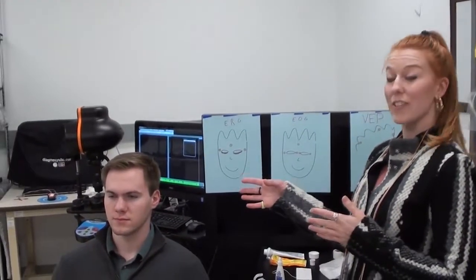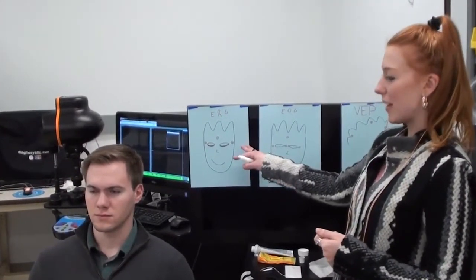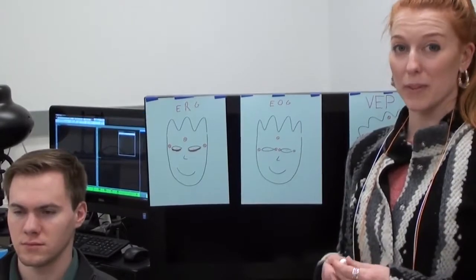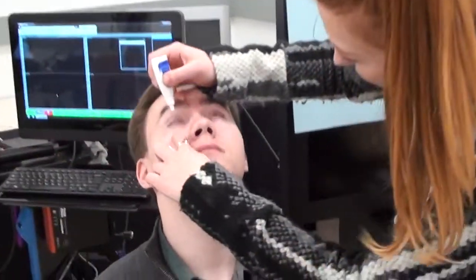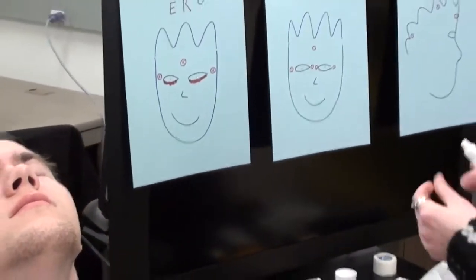Now we're going to do a demonstration of the electrodes set up on a patient for an ERG test. We're going to want to use dilation and numbing drops, so we apply those to the patient and wait a minute or two.